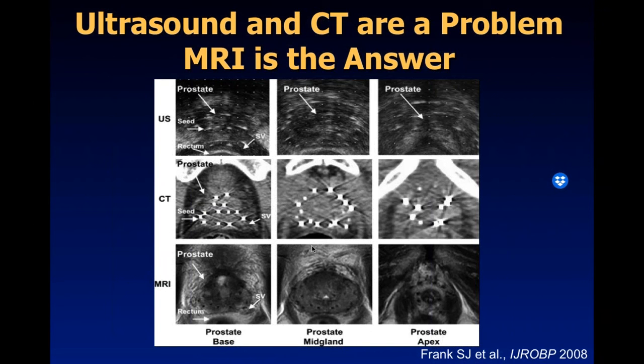Post-implant assessment and dosimetry is critical because the procedure is not over till you've evaluated your quality. And the two reasons you need to evaluate the quality of what you've delivered are, number one, if you haven't delivered a high quality implant, you may need to take the patient back to the operating room to add a few more seeds to optimize the treatment. And number two, what you can learn from that implant, you can improve for your next implant. So post-implant quality assurance is the critical step in quality assurance in prostate brachytherapy.